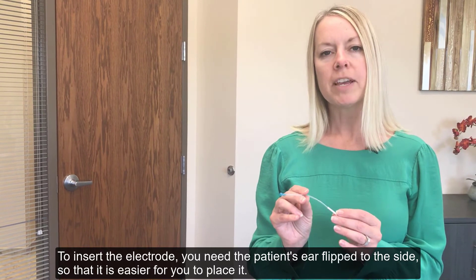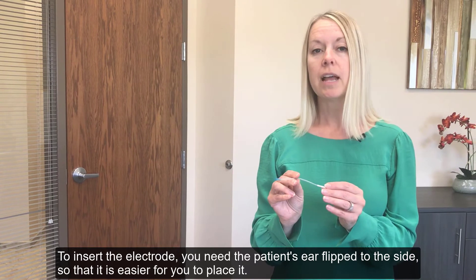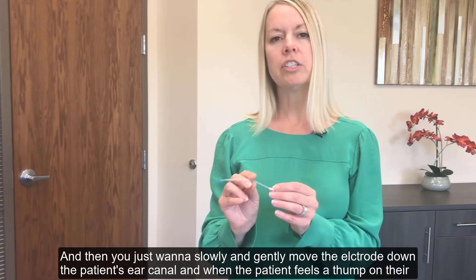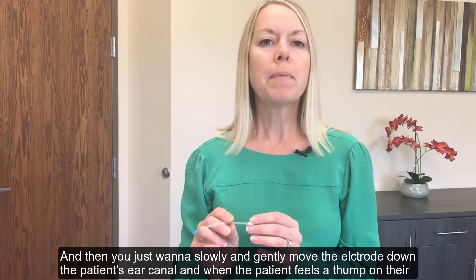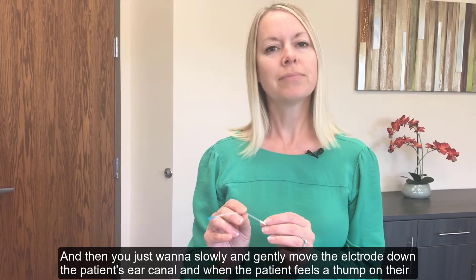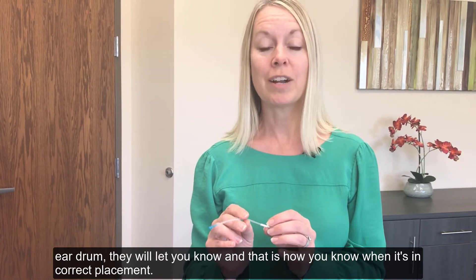To insert the electrode, you need the patient's ear flipped to the side so that it's easier for you to place it. Then you just want to slowly and gently move the electrode down the patient's ear canal. When the patient feels a thump on their eardrum, they will let you know — and that's how you know it's in correct placement.